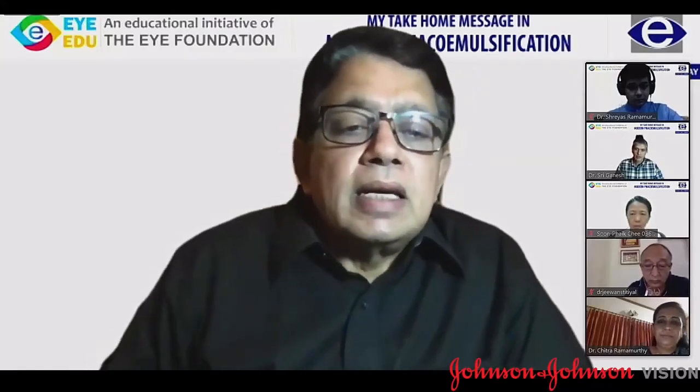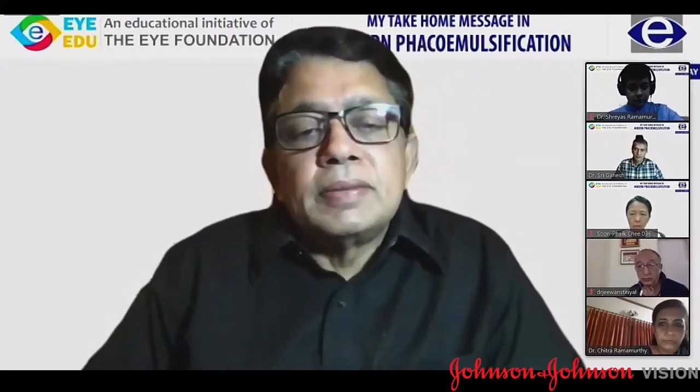Can I say? Yes, Dr. Wavikar. Yeah, please. Two points. We go by the Barrett suite for the first eye, but when it comes to the second eye, it is important to see the IOL power on the Barrett suite, Barrett, Hill-RBF as well as SRK/T optimized. Because suppose you are left with a plus 0.5, and if you look at the IOL power of all three formulae as recommended, you definitely get an idea what to implant in the second eye.